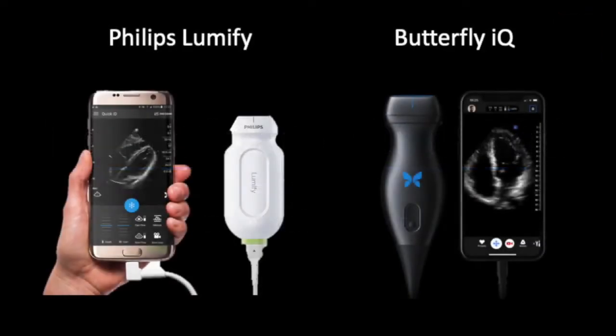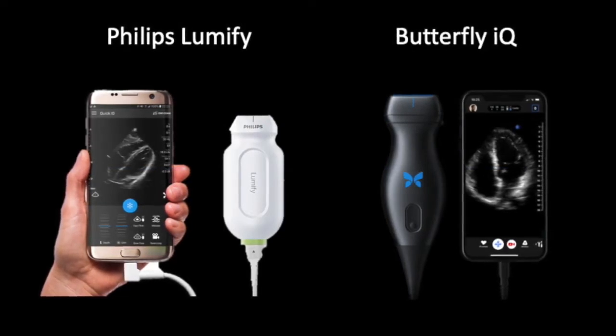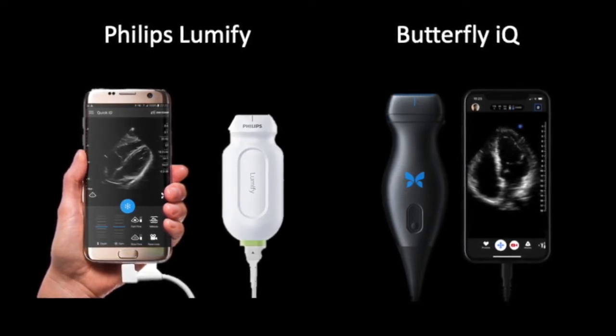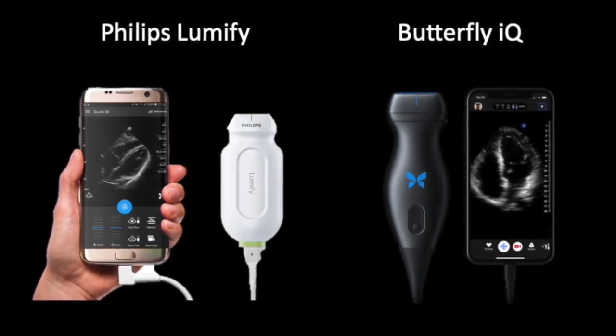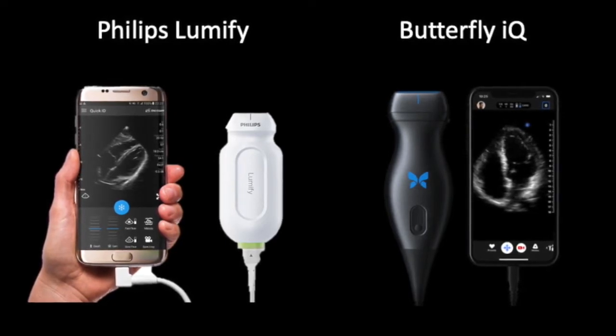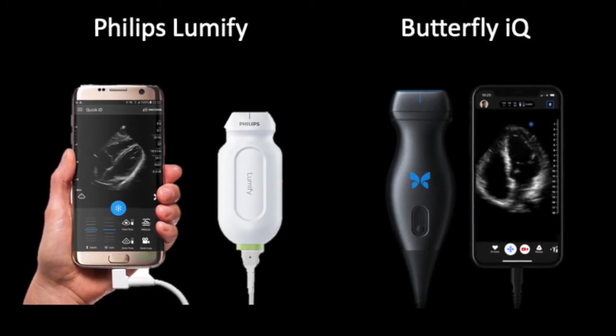We actually have two different ultrasound devices that you're going to use on a regular basis. The first is something called the Philips Lumify. Philips is a well-known manufacturer of ultrasounds over several years. And with these Lumifys, we have traditional phased arrayed probes. They're great at cardiac, abdominal, and obstetric exams. It will be hooking up to an Android device, which is provided with the ultrasound.